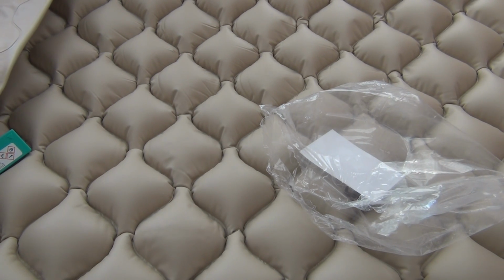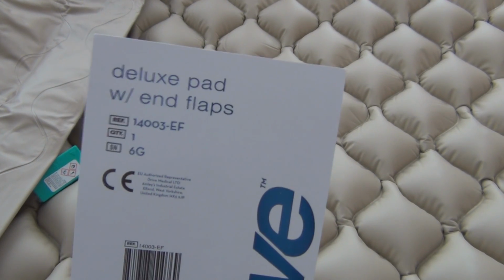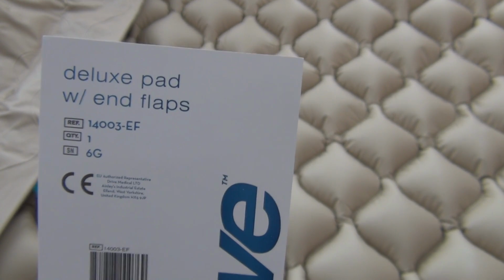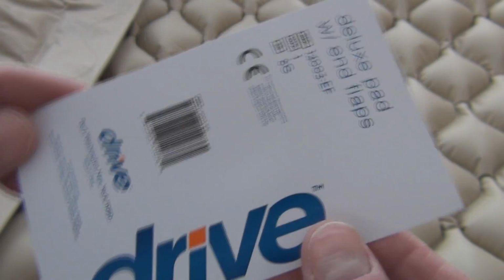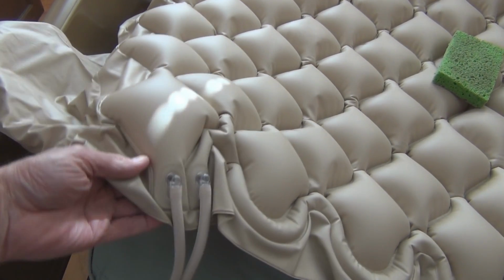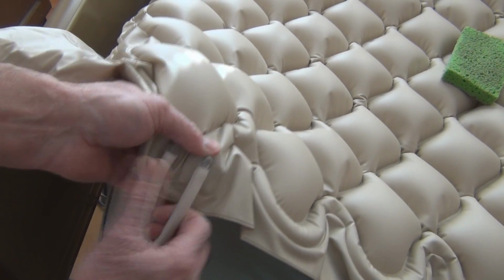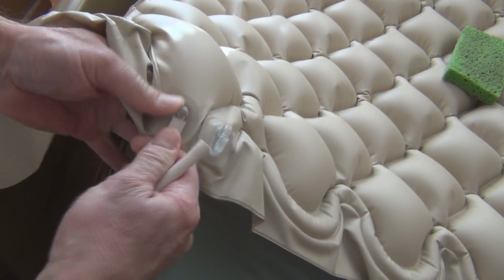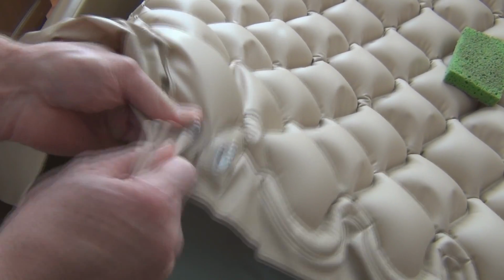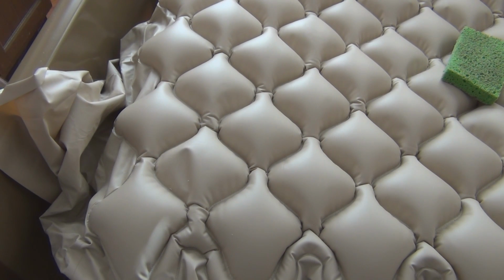So let me take the old one off. So here's the product here. Deluxe pad with end flaps. There's a reference number there. I'm just going to, I guess I can just turn the pump off, doesn't matter, and just connect. Just pressure fit. I just press on there, and then immediately it will start deflating.